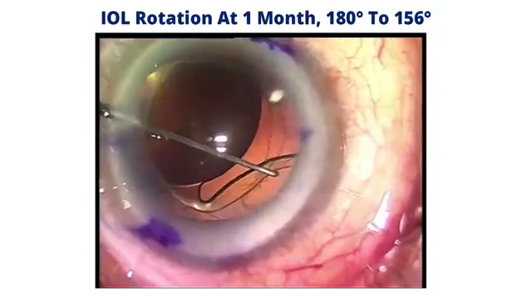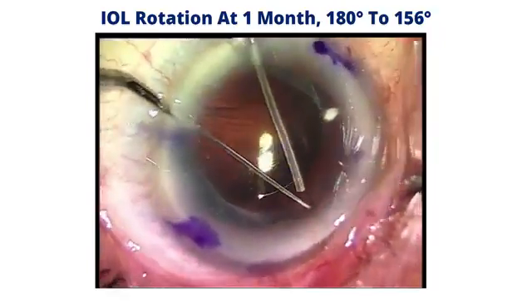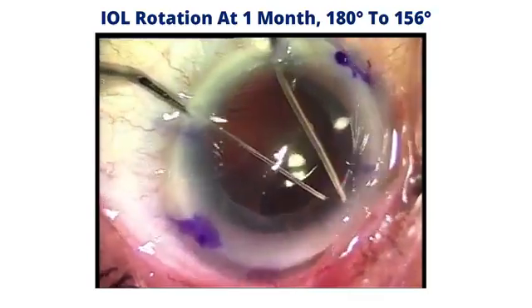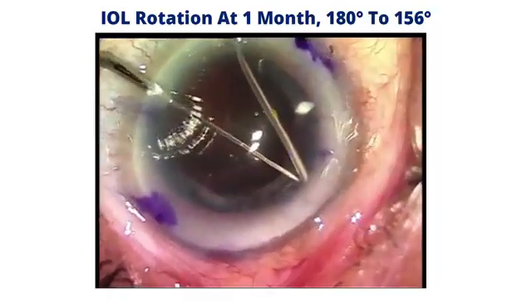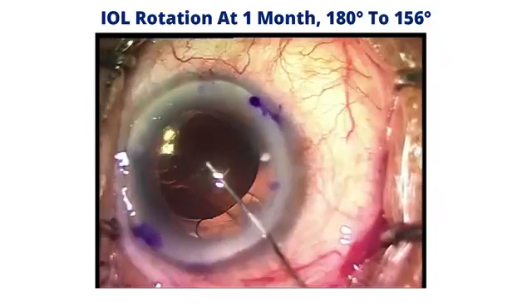The knob there is stuck. Okay, so I'm going to have some additional help come in. With my other hand, inject viscoelastic as I dissect again, and I'm just trying to pull forward the haptic, and you see I was successful in a bimanual technique.